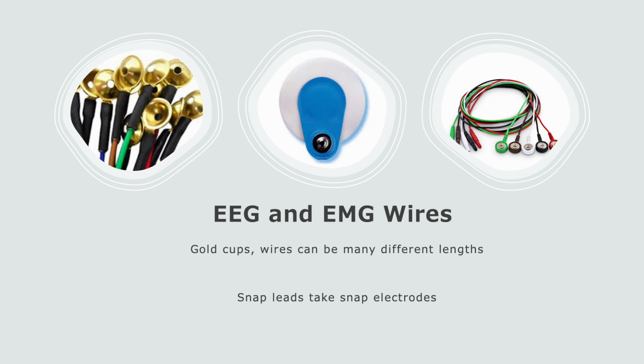There are also snap leads and the snap electrodes, which are good for limb EMG. I've also seen some labs that use snap leads for EOG and EMG, and I find that incredibly hard to keep on the face. They make small snap electrodes that can fit there, but the wires that they hook up to are heavy, and it's got a lot of weight to be held up by a little bit of tape.